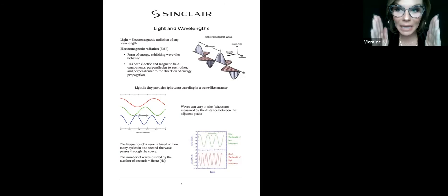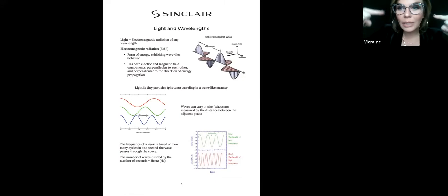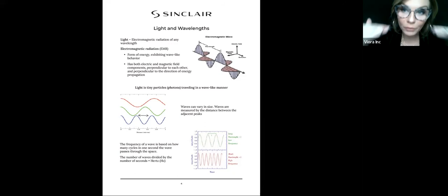So a long wavelength is going to have a very low frequency. So it actually has time to get deeper into the tissue, the way it's traveling, the way it's moving into the skin. Low frequency, it may only peak 3 times in the matter of a second, whereas a short wavelength has a very high frequency. So it's peaking many, many times within a second, and really it's staying more superficial in the skin because of the way it's moving. So longer wavelengths, deeper penetration, lower frequency, and shorter wavelengths, more superficial penetration in the skin, higher frequency.